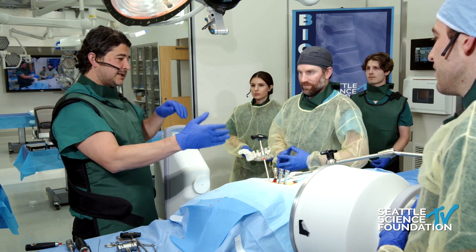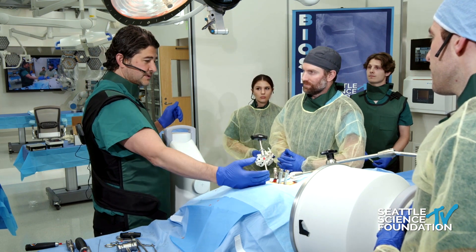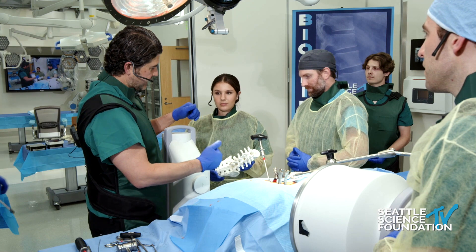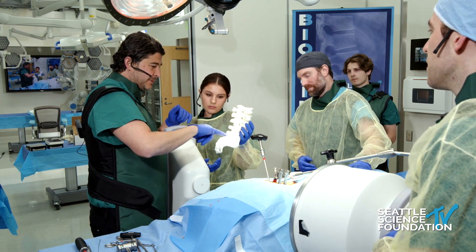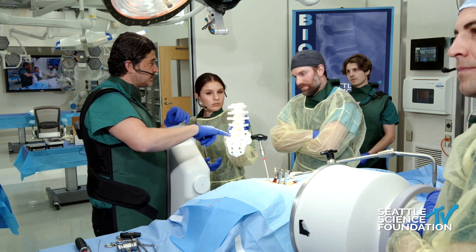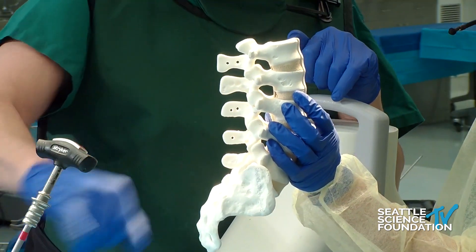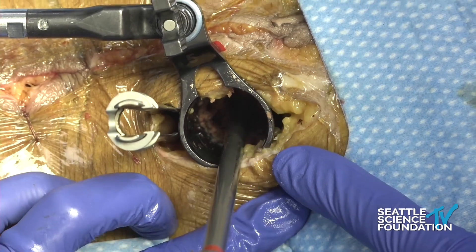We've already put the screws in. Typically what I do is put the contralateral screws in on the other side. Let's say if you're doing an L5-S1 T-LIF — you end up leaving because you have to be able to put the T-LIF cage in. Usually I leave the S1 screw out. That way it gives you access so you can put the L5 screw in. And you can see here we've got a much larger retractor system than we normally would have.